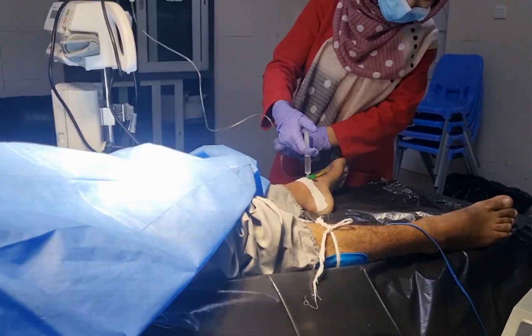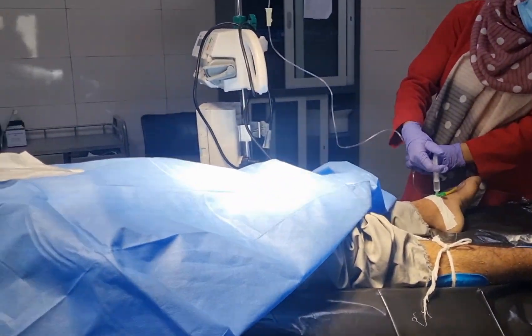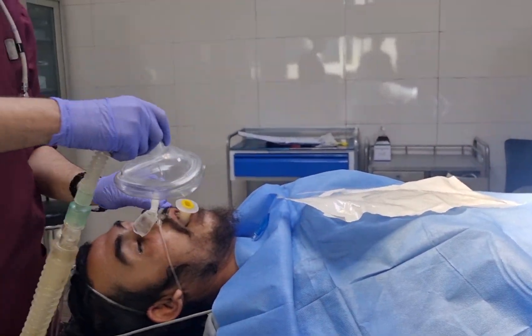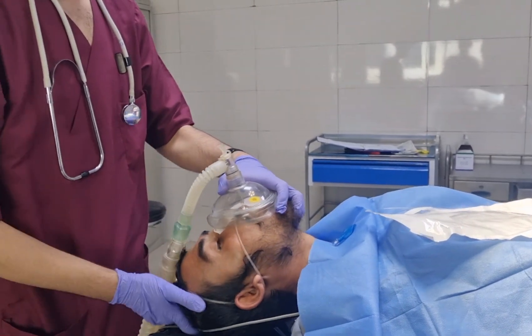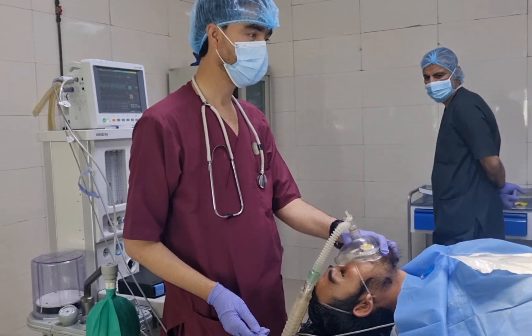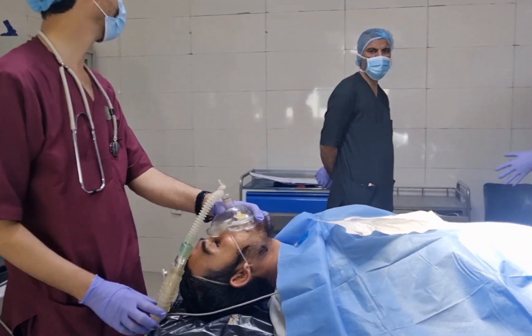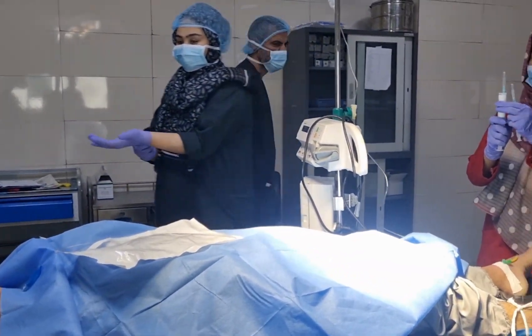This is a critical patient going to general anesthesia. The diagnosis is hydrocephalus, and the operation procedure is being explained. This patient has several chest infections — the chest is not cleared, breathing sounds are abnormal, and there are secretions. However, this patient requires emergency surgery.